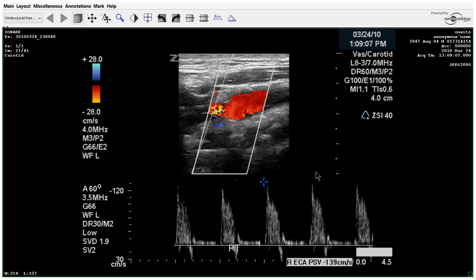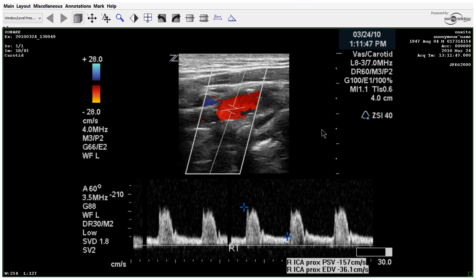Here's the ECA — you can see there's some aliasing. Moving to the ICA, we've already jumped above our threshold of 125, which is what we use with the SRU criteria. So this is already in the 50 to 69 percent range.